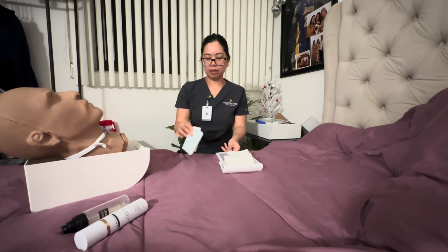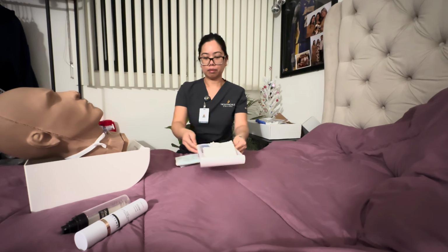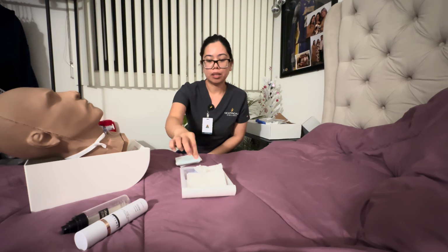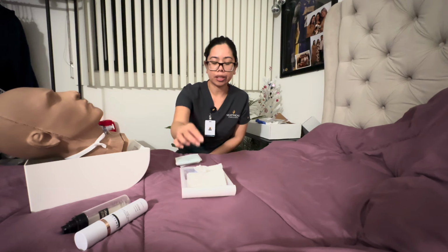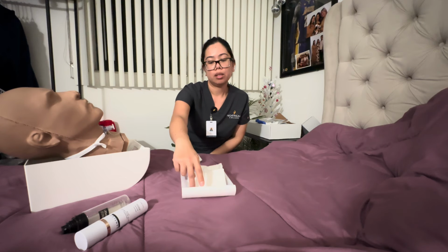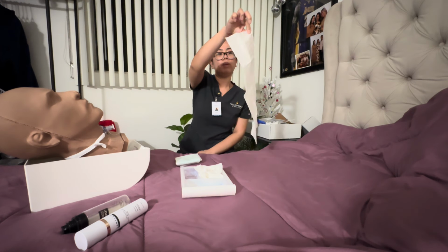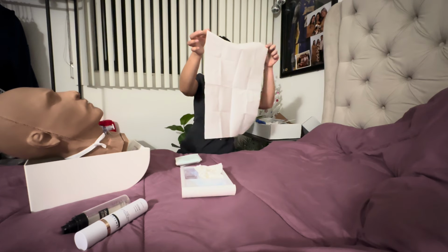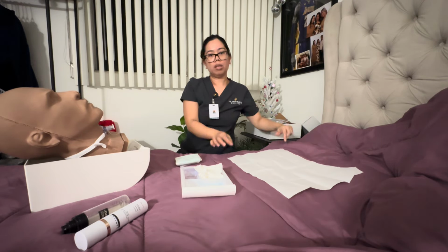This is my sterile gloves. I'm just going to set it aside here. Then I'm going to pick up the white drape, and you can only touch the 1-inch border. There's a fold here. I'm just going to grab it, and then it's going to open up. Only touch the 1-inch border, and we set it aside here. This is going to be our sterile field.